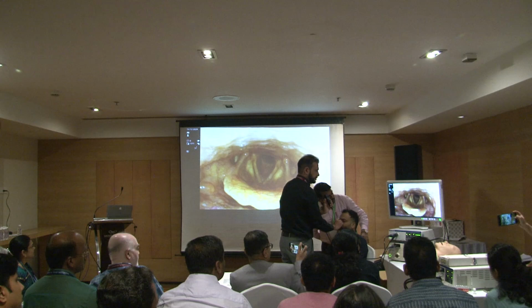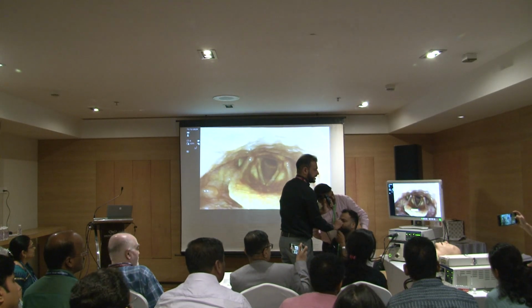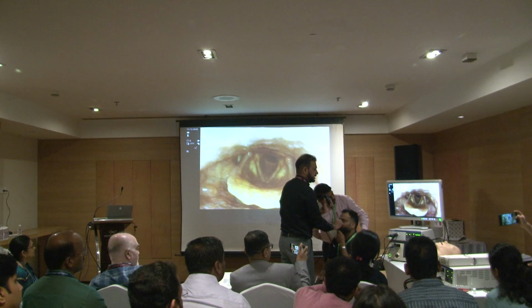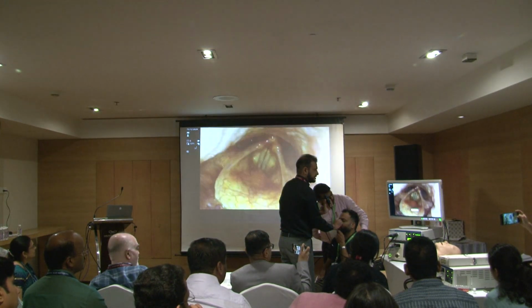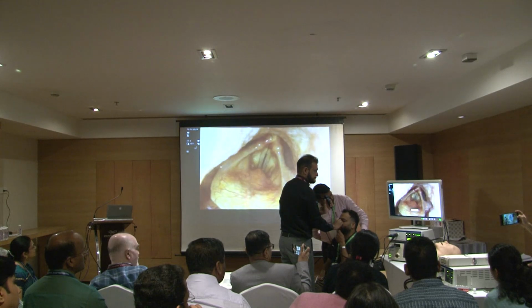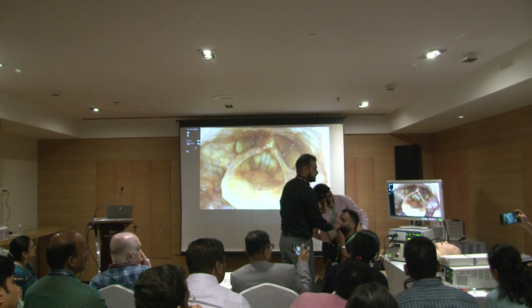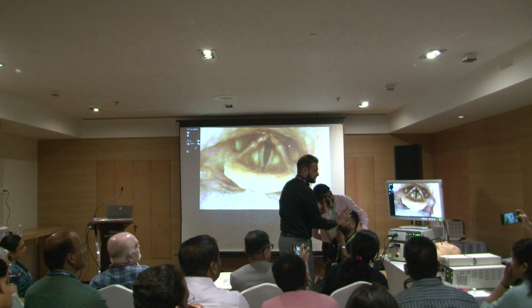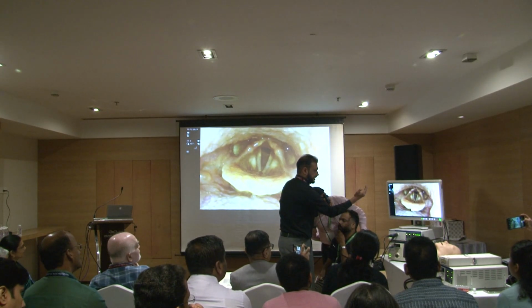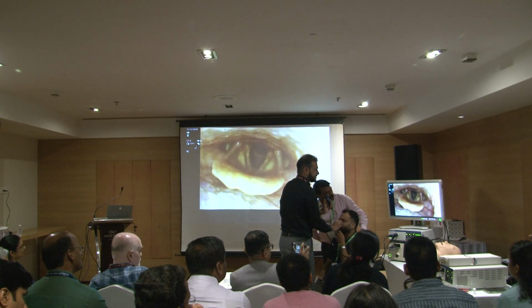Now say normal low pitch. In this, the vocal cord has become narrowed. Low pitch. So the idea is, why are we doing all this? We need to see the upper lip, the middle part and the lower lip of the vocal cord. All three should be seen, only then should the complete assessment be done.